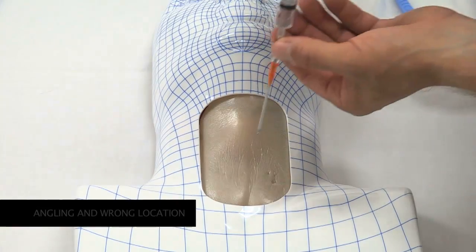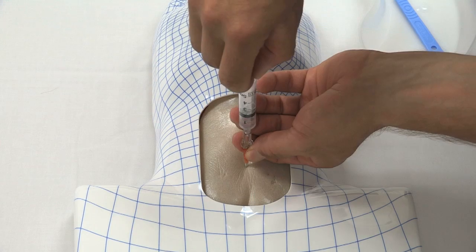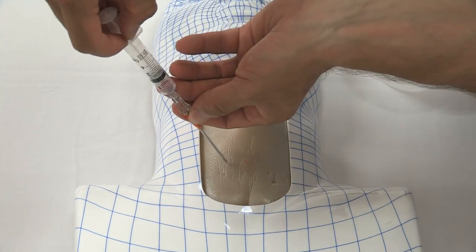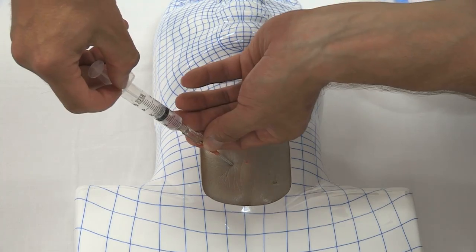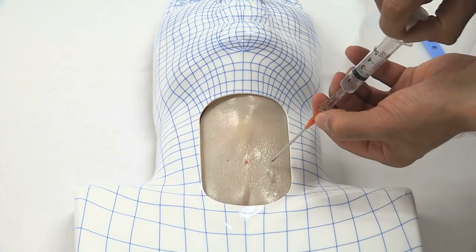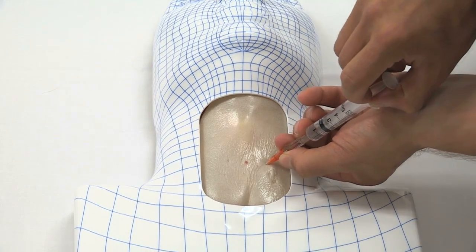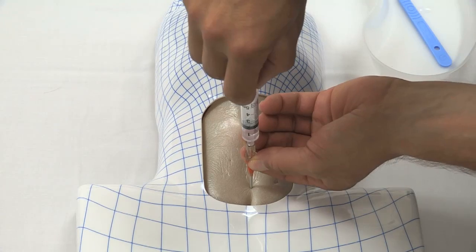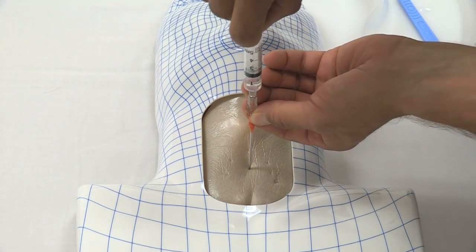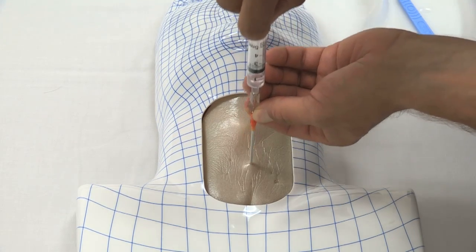After the initial midline cannula insertion attempt, the second and third attempt should be on either side of the midline. The needle insertions on either side of the midline should be in a perpendicular fashion, trying to cannulate a truly displaced airway, and should not be directed towards the midline. Nor should a cannulation attempt be made more cranial or caudal of the initial attempt location.